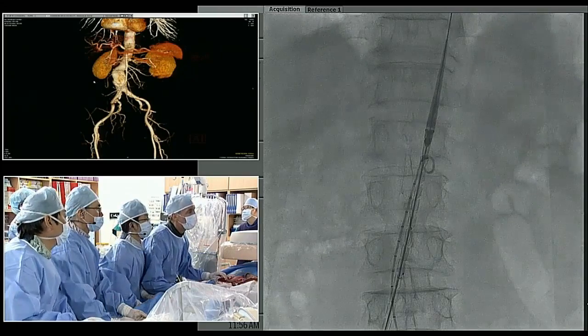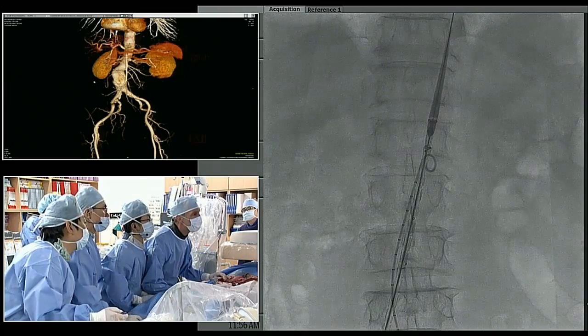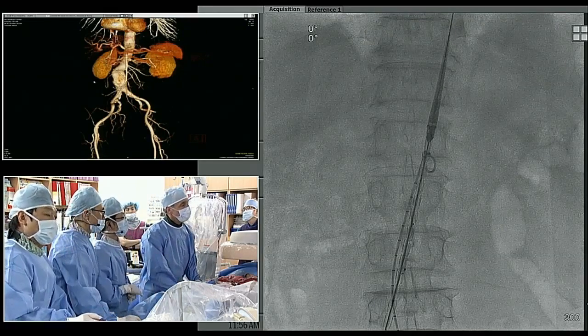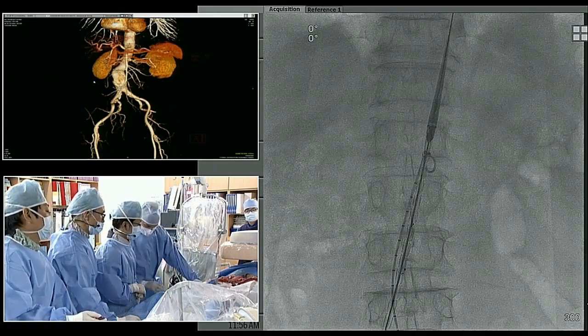Okay, back to you, Bill. Tell us what device you have here. So we have a Medtronic device here, and you can see, I'm just going to take a picture here real quickly. Ready? Yeah.